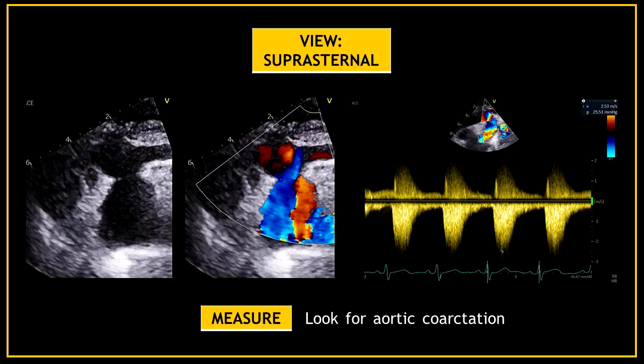It's also important to look for any aortic coarctation. In these images you can see a narrowing of the descending aorta with raised forward flow.